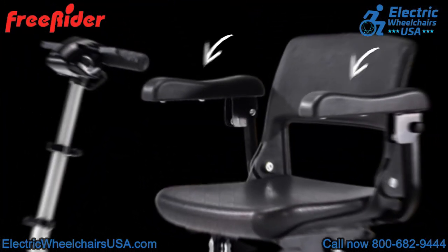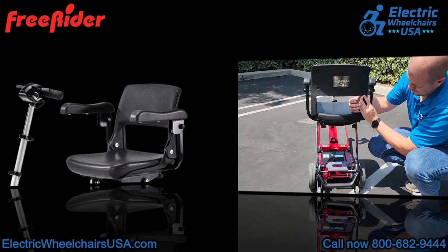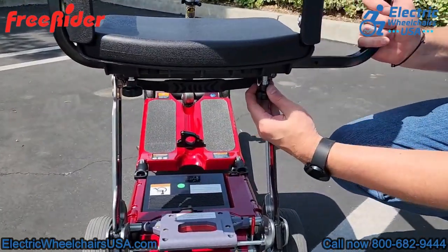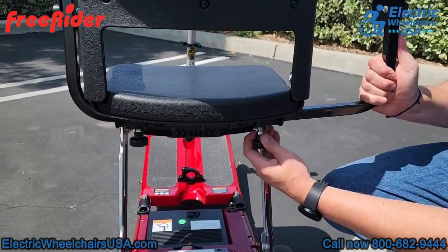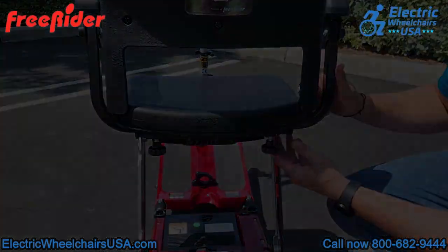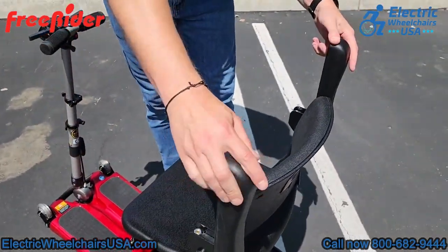This scooter comes standard with armrests — it's not an add-on option, they come standard. The armrests are also width adjustable. You can see these two little knobs at the bottom of the seat; you just pull the knobs down to adjust the armrest width, and you can even remove the armrests if you didn't want them. In addition, the armrests flip up which makes it easier to get in and out of the seat.